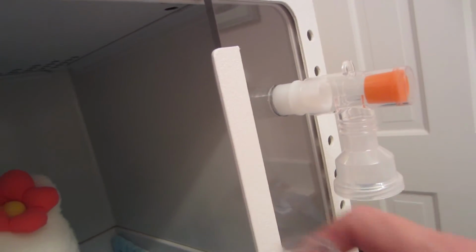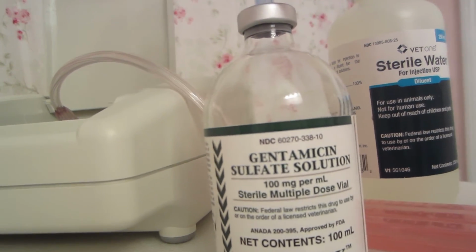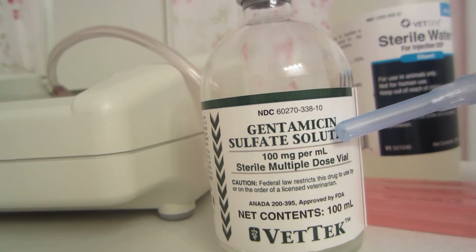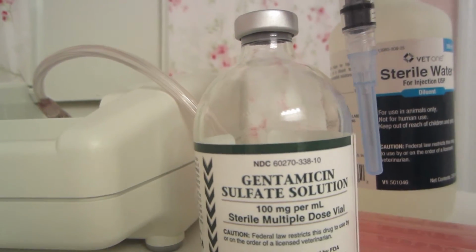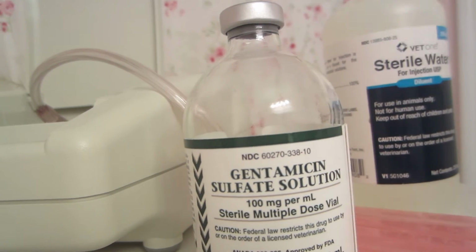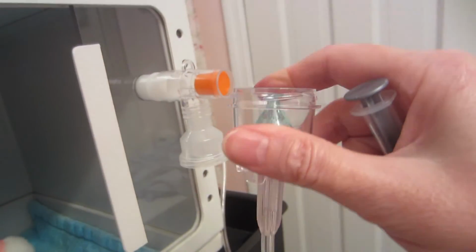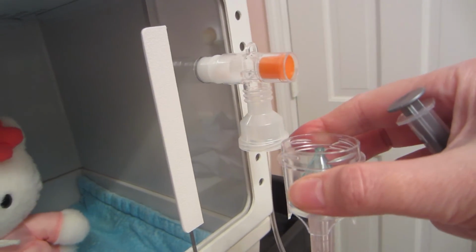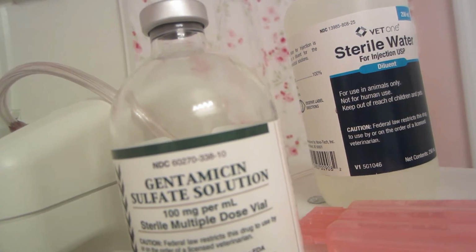And what you need to do is, if you're using the gentamicin, remember you need 250 milligrams, and this is 100 milligrams per milliliter. So I'm going to syringe up 2.5 milliliters, or cc's, it's the same measurement, of gentamicin into my syringe, and I'm going to put that into the bottom of my nebulizer. And then I'm going to add some sterile water or the sterile saline solution, whichever you're using.